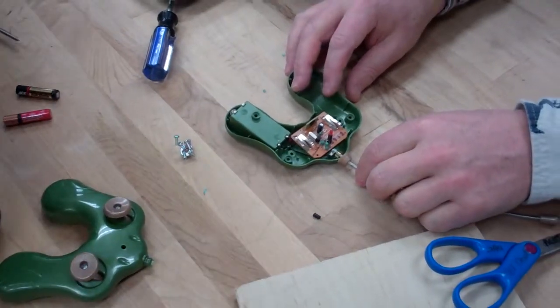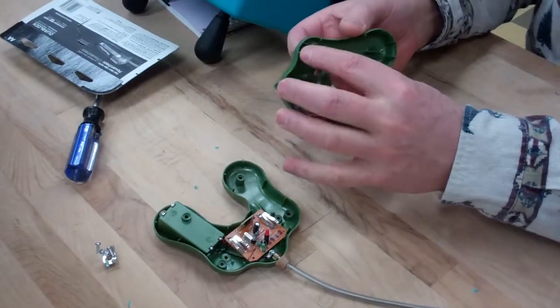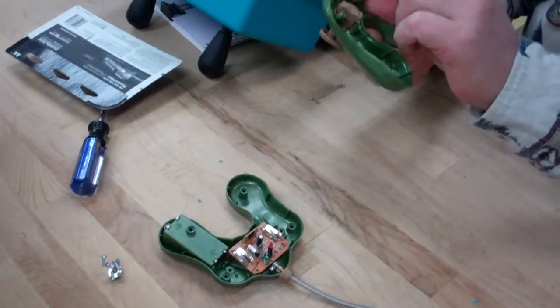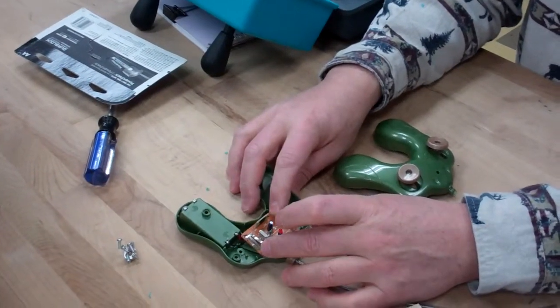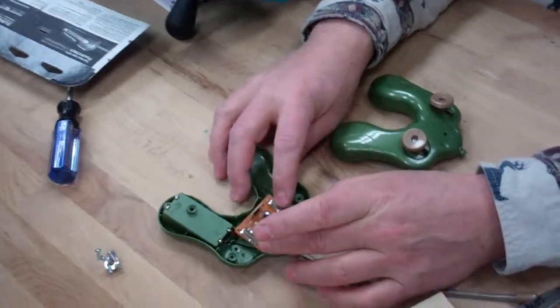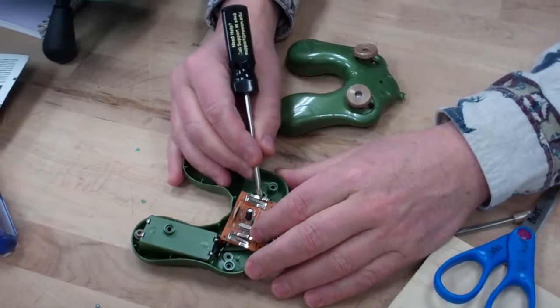The switches inside these controls work by bending a little flat lever back and forth, which pushes one side or the other side of the metal. These are the switches, and they will break down over time because you're always bending and flexing that metal.